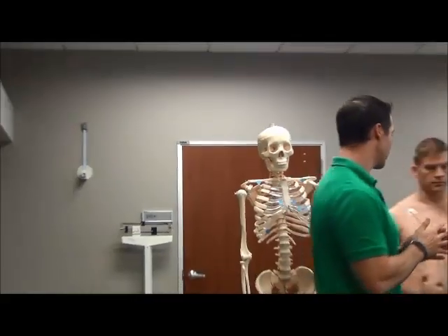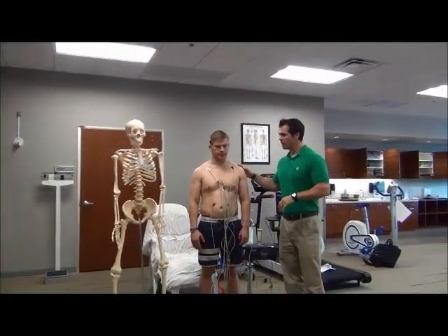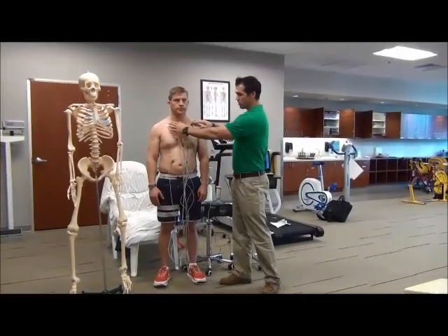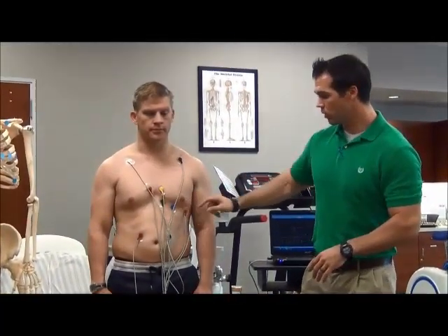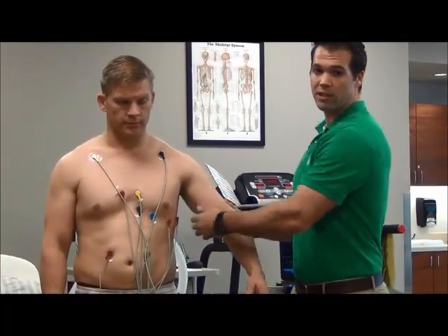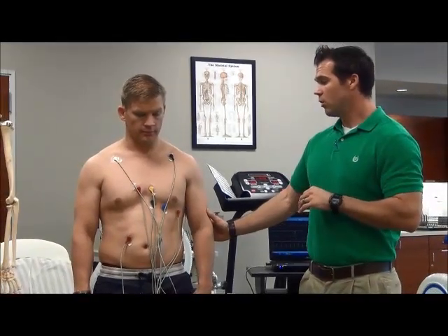Curtis is our client today. We have him set up already. So you'll see his arm leads are up here, right under his clavicle. These are his arm leads. Here are his leg leads. For his chest leads, you have V1, V2, and then it's really wrapping that heart under the armpit. You have V6, which will allow us, again, to get 12 different pictures of the heart.